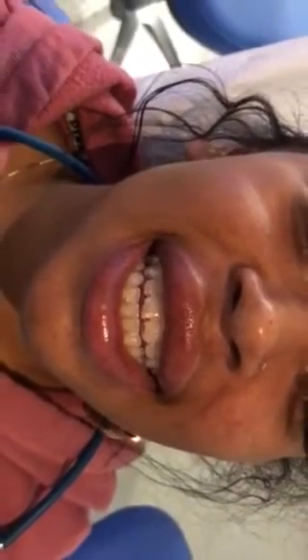You notice she's only feeling pressure on the teeth that are required to move. The process is we digitize the teeth, we move them on the computer, and we fabricate the clear new brace aligners to bring those teeth down. Every month you get a new set, and that's it.